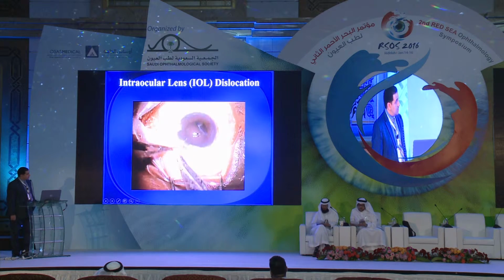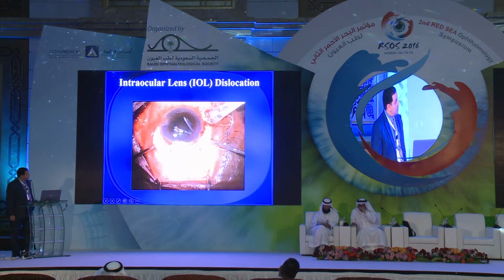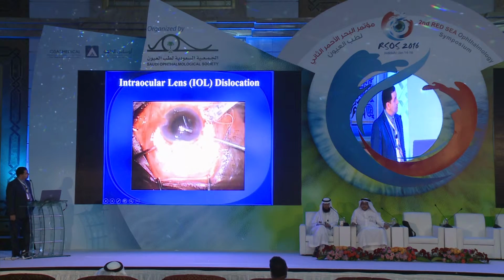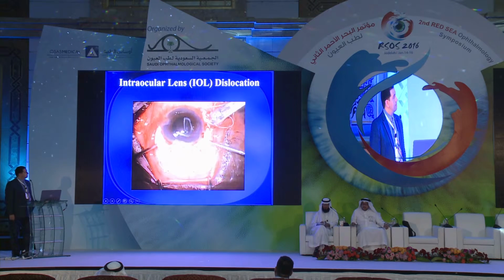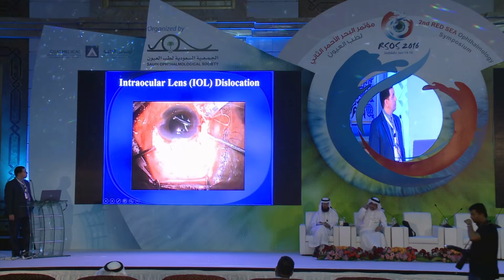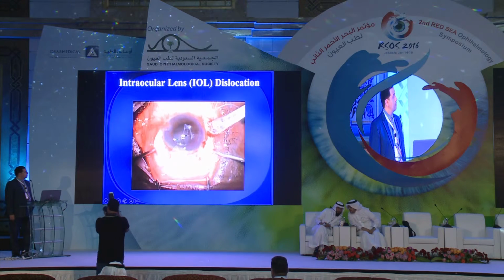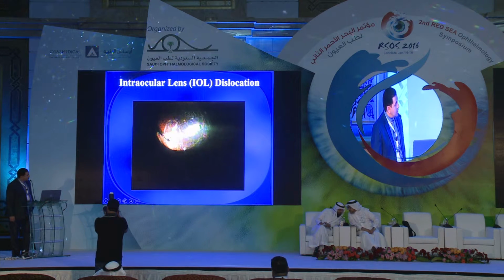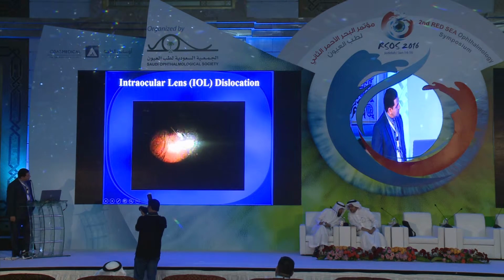In this video, there is a whole compartment dislocation, the lens with capsular tension ring and the whole bag. This is 20 gauge. First of all, we clean the anterior vitreous. As we see, the lens is floating here. Now we are doing core vitrectomy and also shaving of the vitreous base because the lens is always stuck in the periphery.